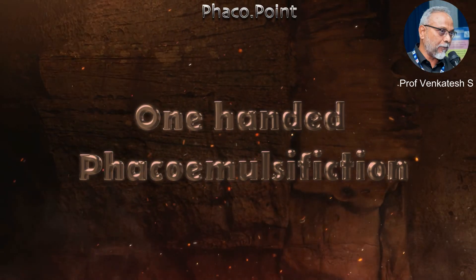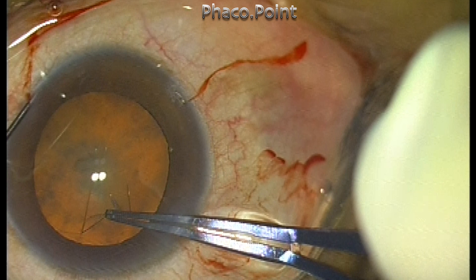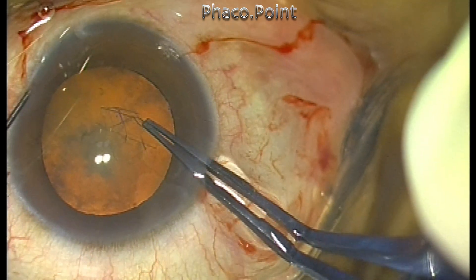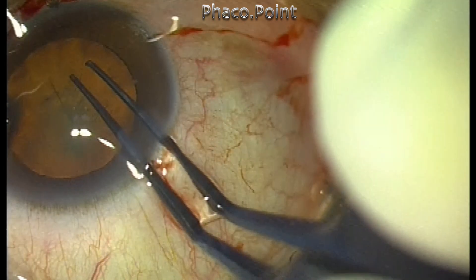Hello, my dear friends. In this particular case, I was forced to perform a one-handed phacoemulsification because I chose the side port incision at a very bad location. Let us observe this case, which was a Grade II Nucleosclerotic Cataract.